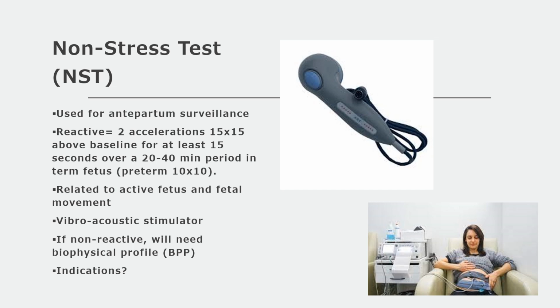Okay, so I already talked about the non-stress test, but this is the vibroacoustic stimulator. That's what it looks like, okay? If we don't get what we expect to see, we don't get the accelerations, then we'll move on and do what's called a biophysical profile or a BPP.